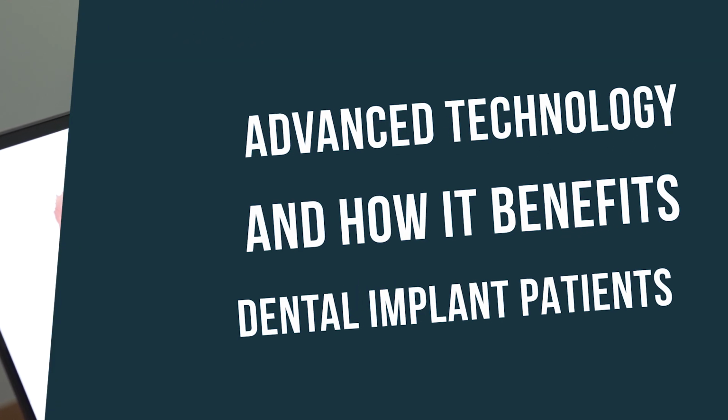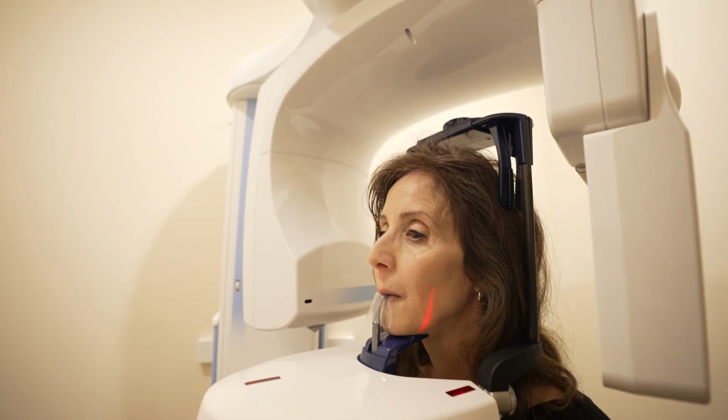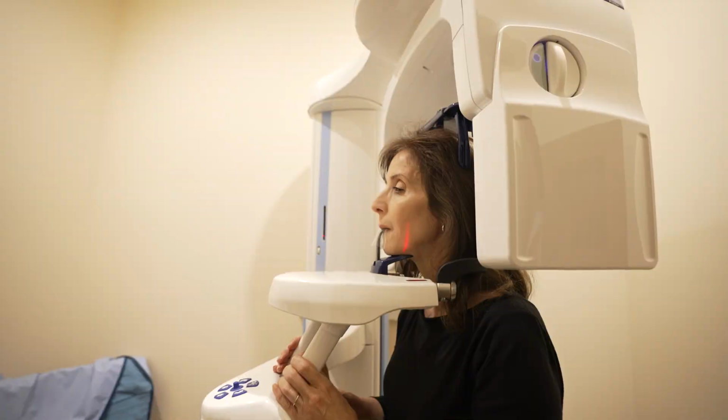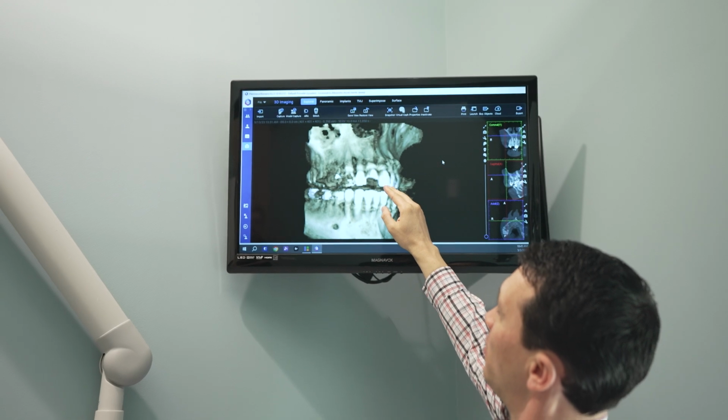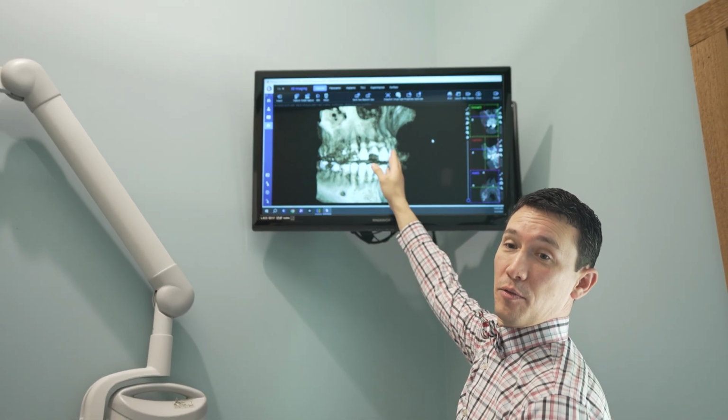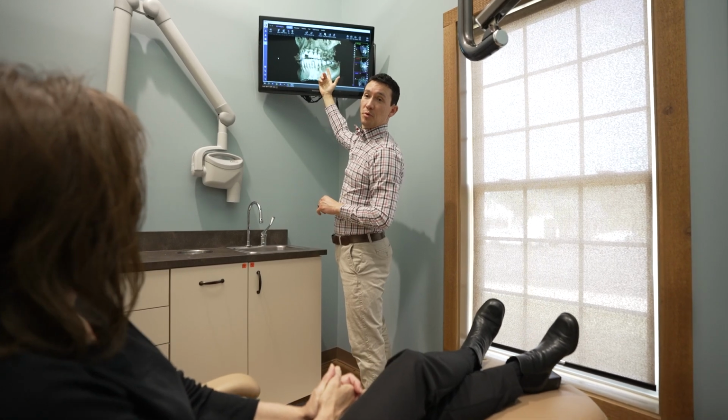I think one of the foremost is the CBCT, or the cone beam computer tomography dental radiograph. So long story short, it's a 3D x-ray. For years and years, we've had small little two-dimensional x-rays, which are great, but they only give us 2 dimensions. And when you're looking at a 3-dimensional situation, having a 3-dimensional x-ray lets us know height, width, depth, and it lets us plan for a lot more and see a lot more than we previously could. Helps us be a lot more minimally invasive.